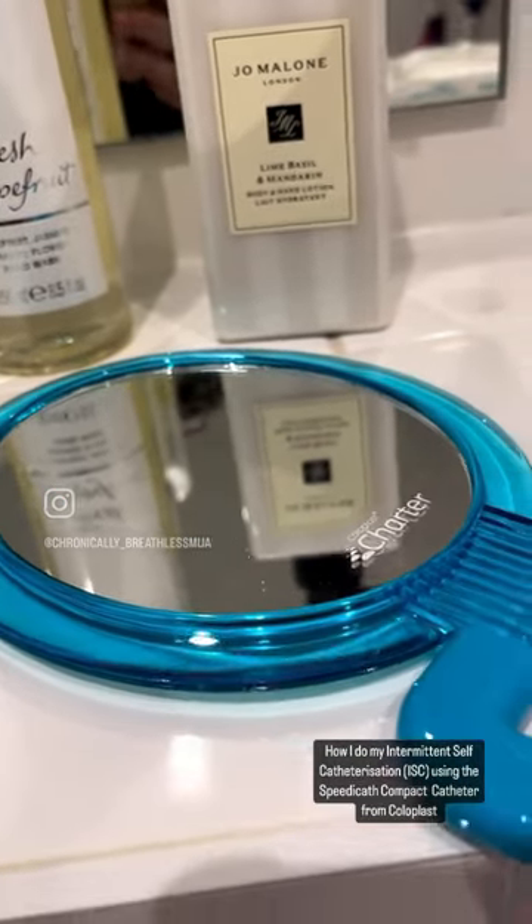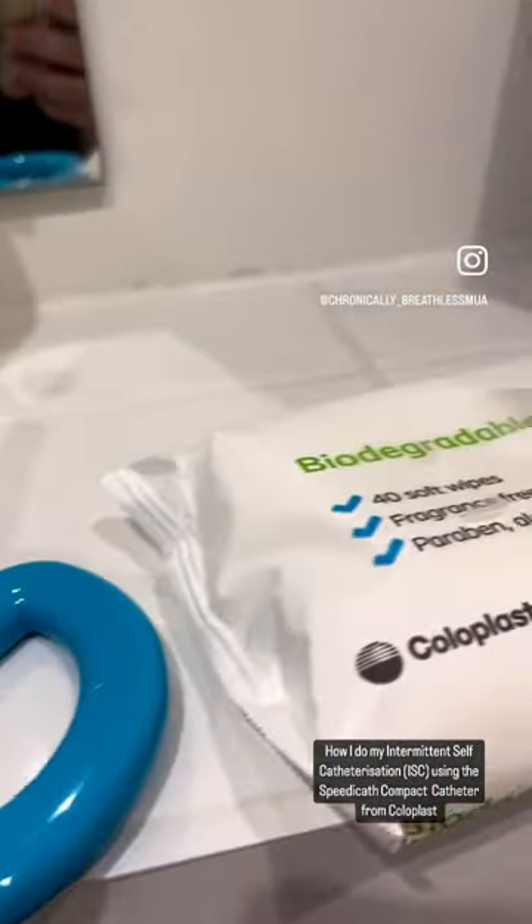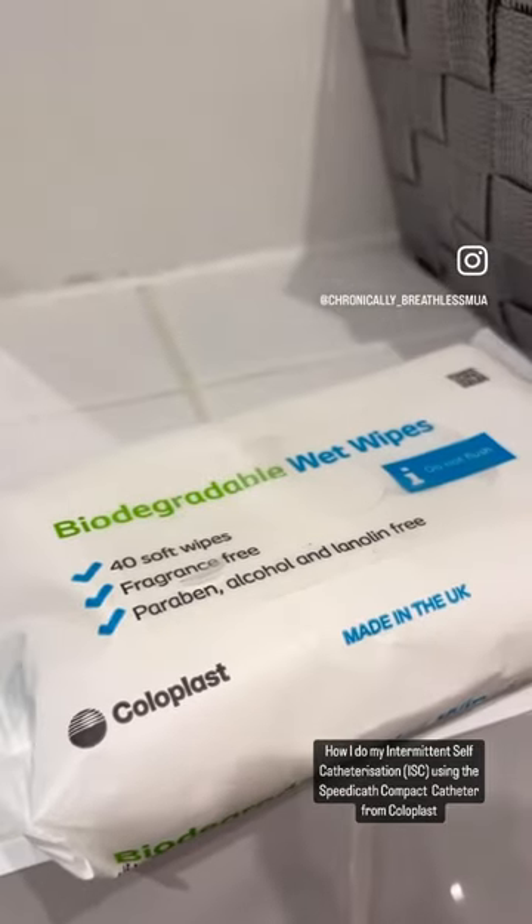This is my guide to intermittent self-catheterisation. First, make sure you have a clean space — biodegradable wipes, a mirror if needed, a rubbish bag, and of course a fresh catheter. This is the Speedy Cath Compact from Coloplast.